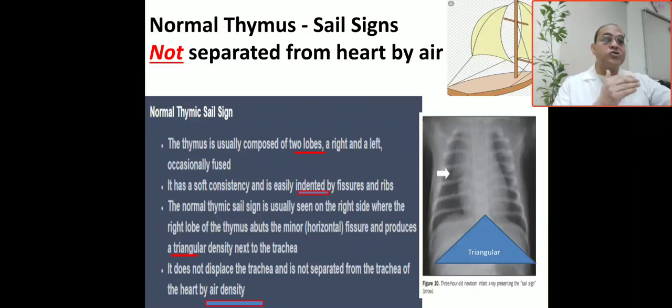The normal thymic sign: the thymus is composed of two lobes, right and left, sometimes fused together. The thymus is soft in consistency, so it is easily indented by the fissure and rib. The base of the thymus is made by the fissure and rib. The right lobe of the thymus gives a triangular opacity next to the trachea. The base of this triangle is made by the fissure and ribs, but not separated from the heart or mediastinum.